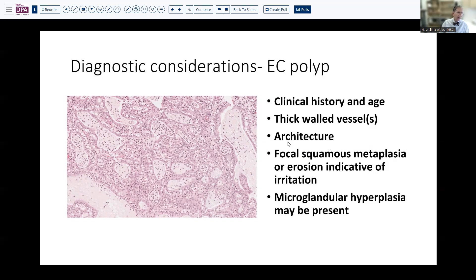Usually with two of these criteria, you can be perfectly fine with the diagnosis of endocervical polyp. Because these polyps protrude into the cervical os, you very often get some degree of squamous metaplasia or inflammation, or even a glandular proliferation with neutrophils and watery clear cytoplasm with basal vacuolization — characteristic of micro-glandular hyperplasia.